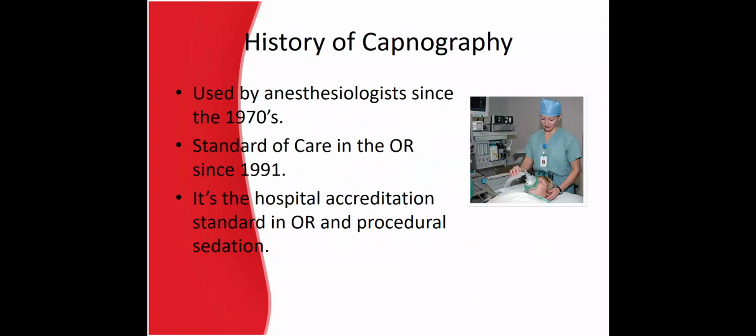Capnography use goes back to the 1970s by anesthesiologists in surgery. Capnography became the standard of care in the OR in 1991. Today, capnography is the hospital accreditation standard in the OR and for procedural sedation.